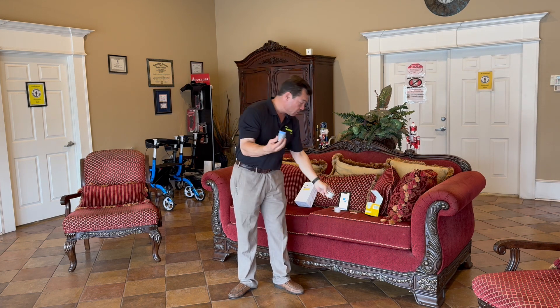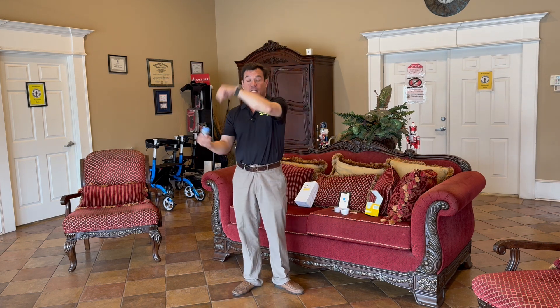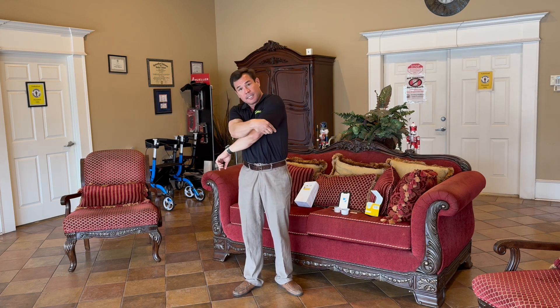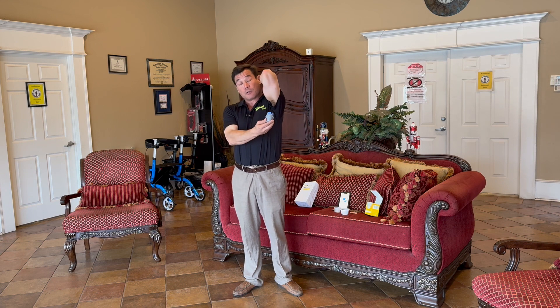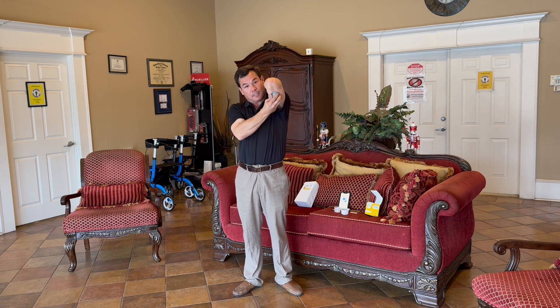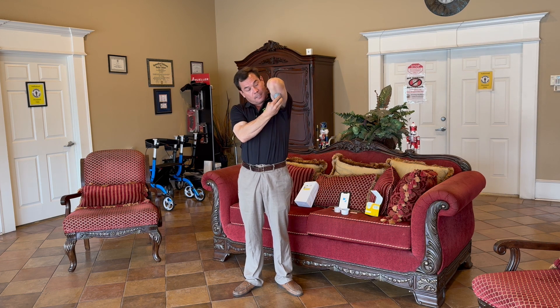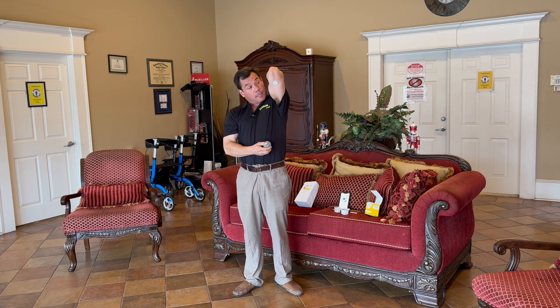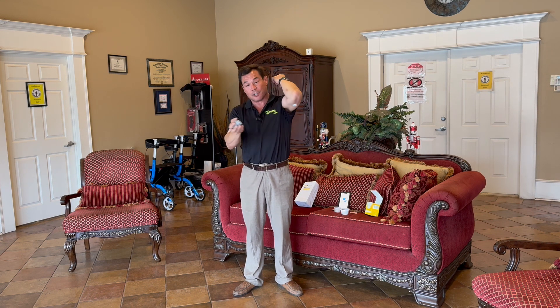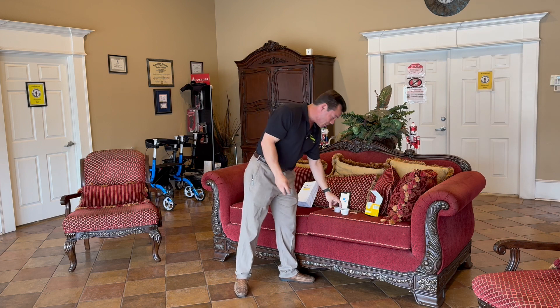Here's a piece of advice when applying this: don't reach across your arm or across your body. It doesn't give you as good a placement as simply lifting your arm straight to the sky. Take your sensor, hold it in place for a couple of seconds, then remove the applicator and your sensor should be adhered. Always go and check it, make sure it's on there good, and you're good to go.